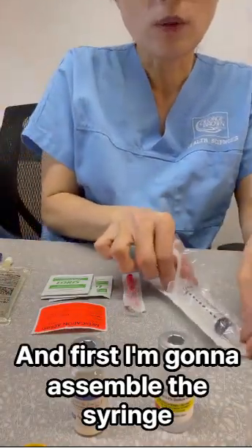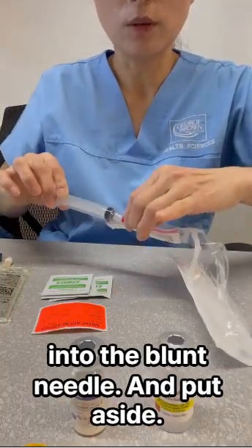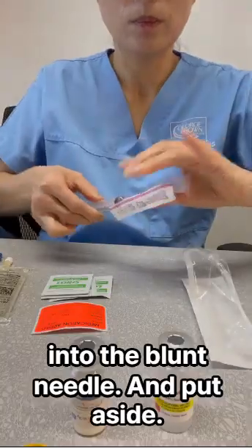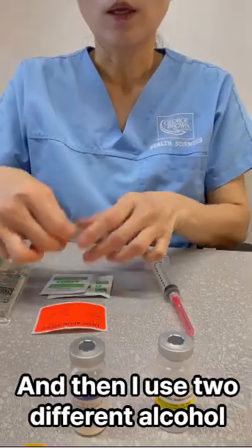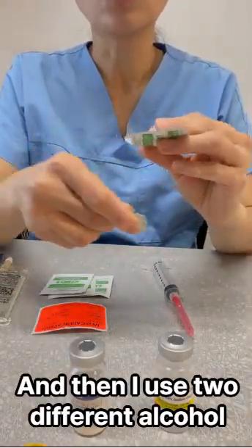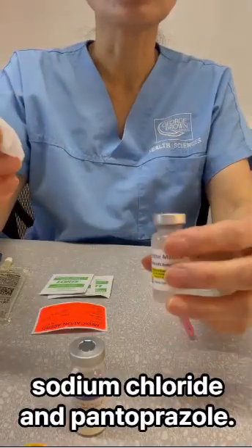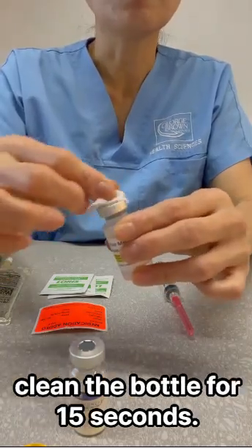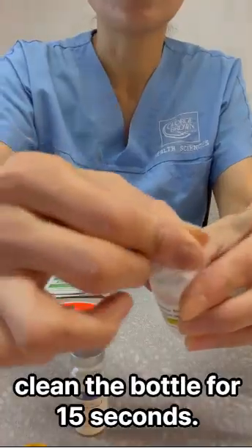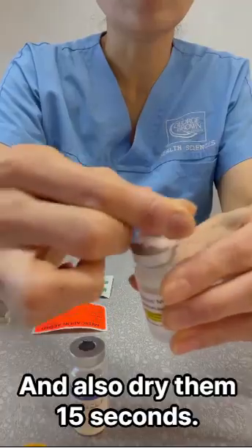First, I'm going to assemble the syringe with the blunt needle and put it aside. Then I use 2 different alcohol swabs to clean the sodium chloride and the pantoprazole. I use aseptic technique, cleaning the bottle for 15 seconds, and also dry them for 15 seconds.